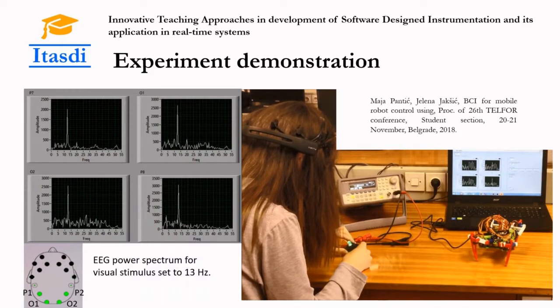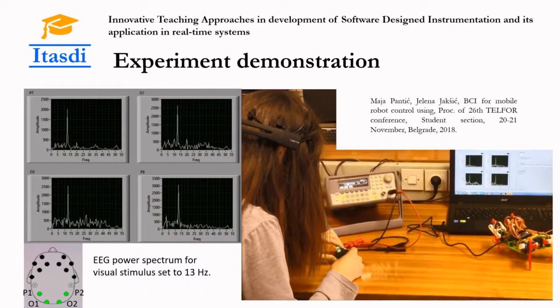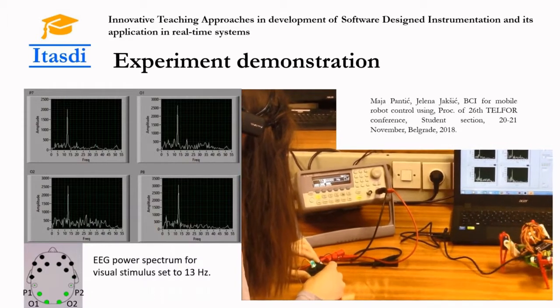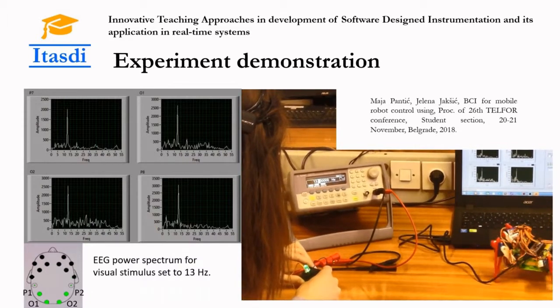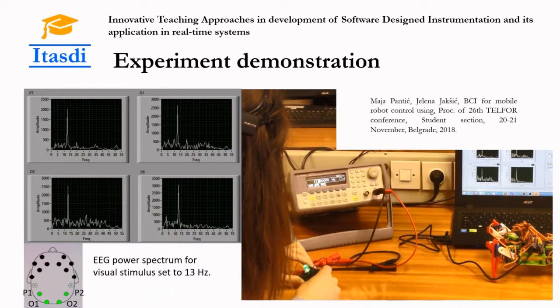On this slide, at the left side, you can see the graphical user interface with EEG power spectrums in parietal and occipital regions when the frequency of visual stimulus is set to 13 Hz. On the right side, the demonstration of the realized BCI system is presented.